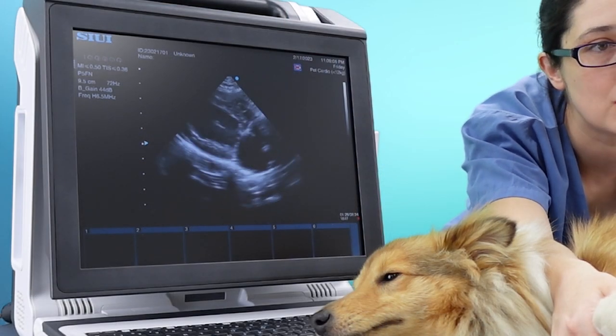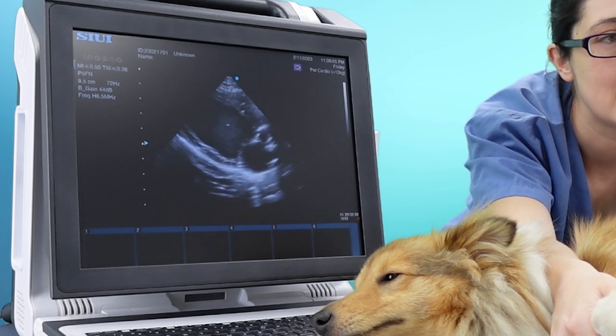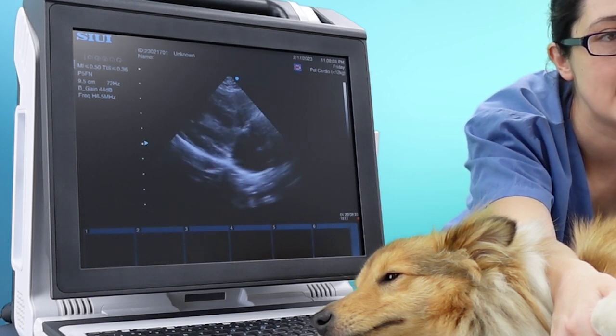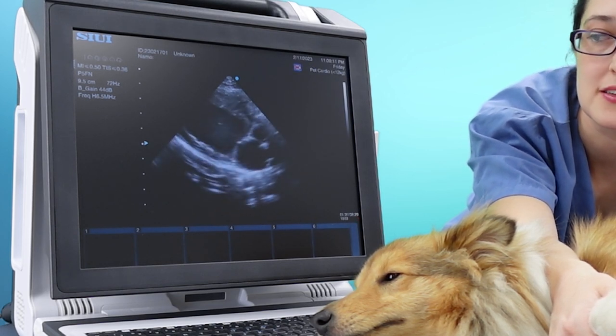To bring your image on axis, shift your hand up cranially one or two rib spaces.